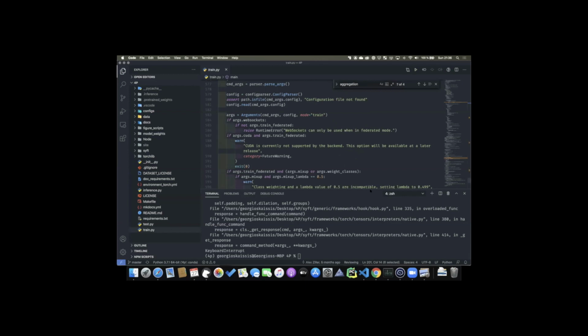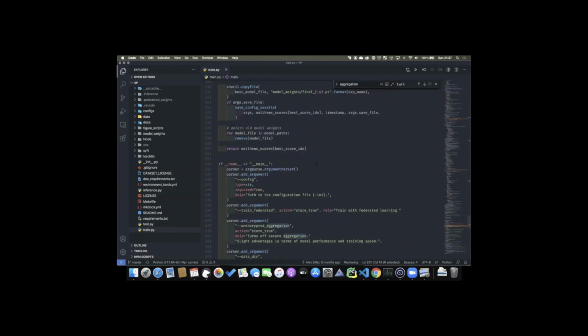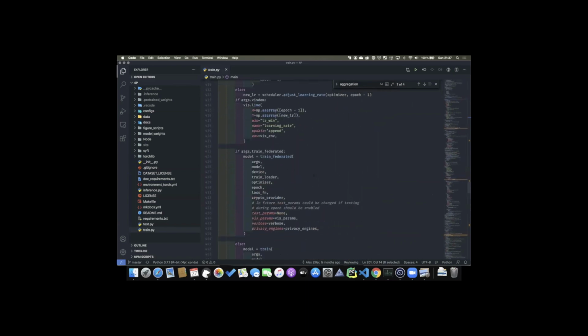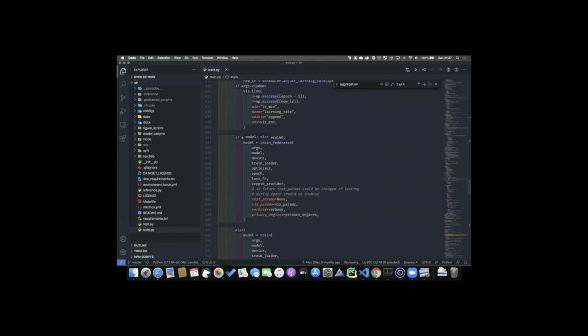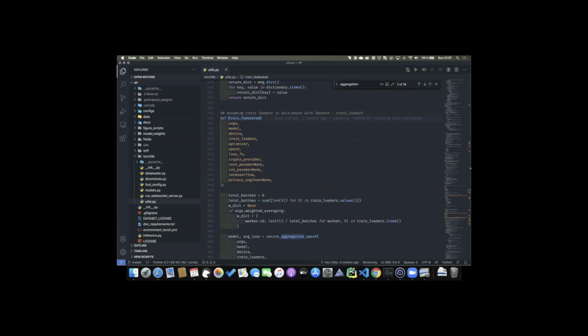Yeah, definitely. This is something we were very particular about from the start, that we wanted to be able to use any PyTorch model. So in this train.py, you'll be able to have a look at all of the logic which is used. But the reality is that there's really just this train federated function. And this is super basic, right? It uses the arguments, a model, the device to put them on, the data loader, optimizer, and some parameters.